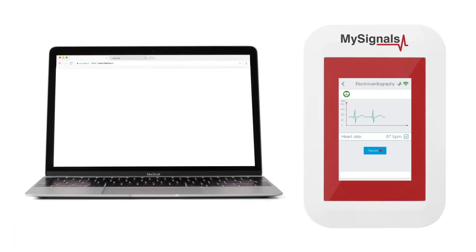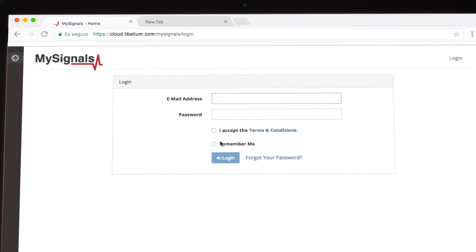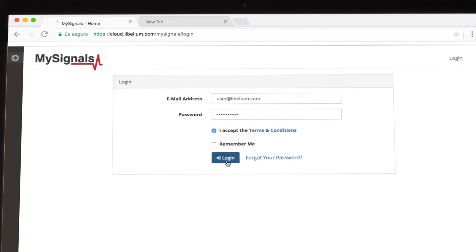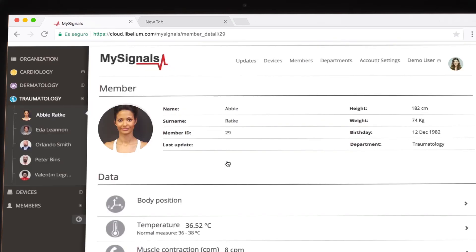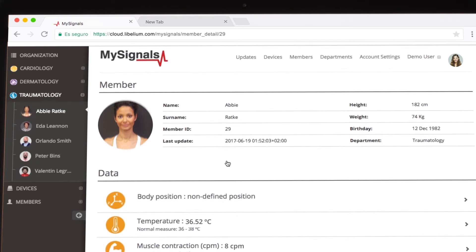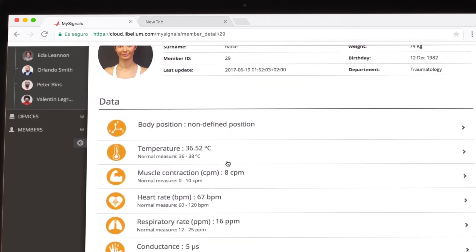In order to see the monitored information on the cloud, log in to the MySignals website with the credentials given by Labellium. Once you access the website, the Member Profile page appears.